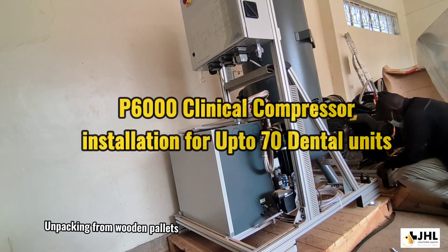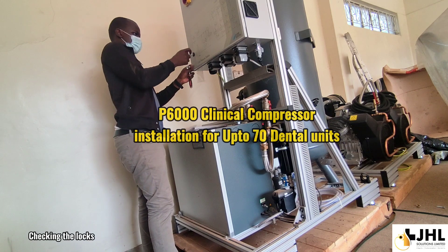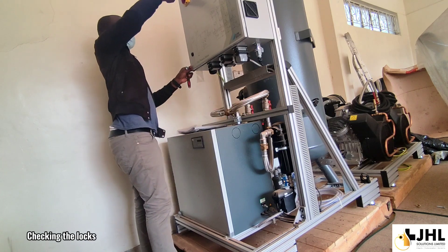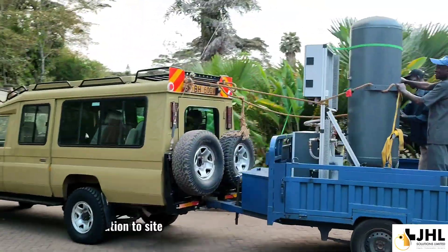P6000 Clinical Compressor Installation for Opto 70 Dental Units. Transportation to site.